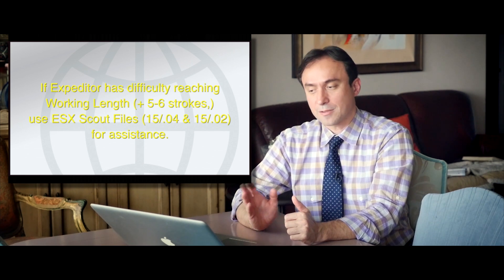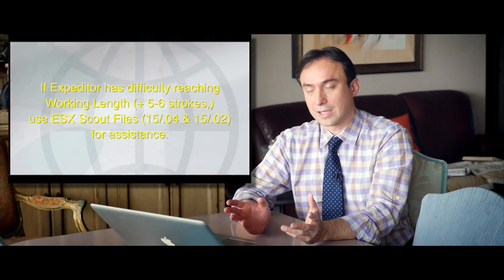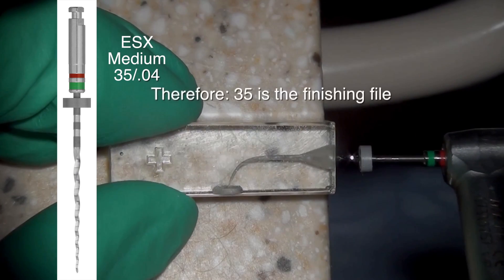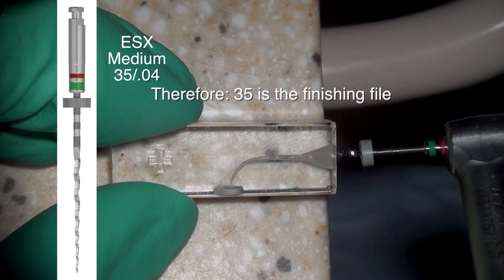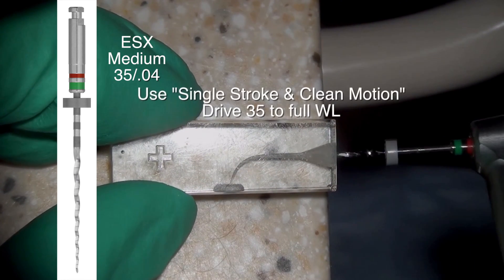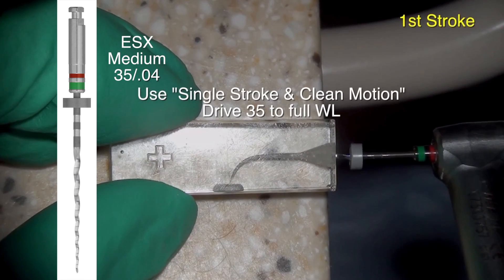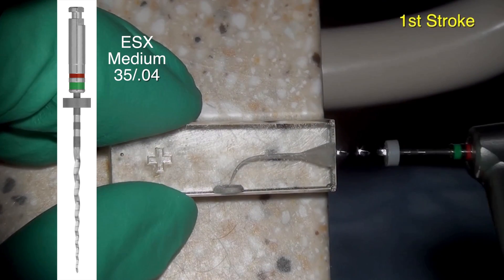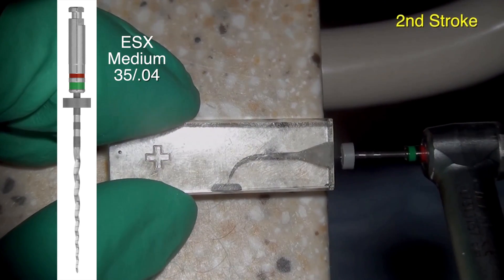We're going to talk about the advanced technique as well. Just realize that if the expediter had difficulty reaching the apex after about five to six strokes, you're going to need to apply the advanced protocol, which we'll cover in a separate tutorial. Here, we can see that our 35 is fitting about four millimeters from the apex, and we had mild engagement in this case with five strokes. Therefore, we chose a 35 to finish, using it in the same SSC motion — one stroke and then cleaning the file.